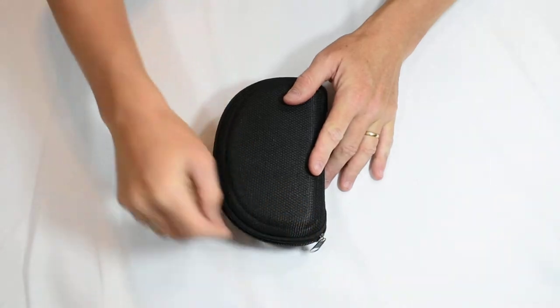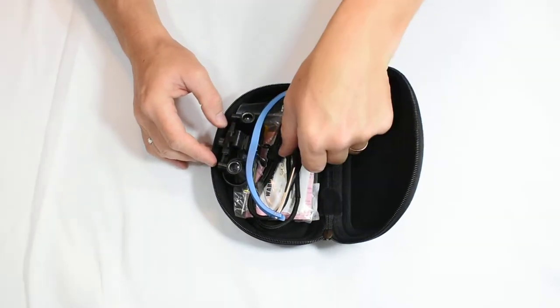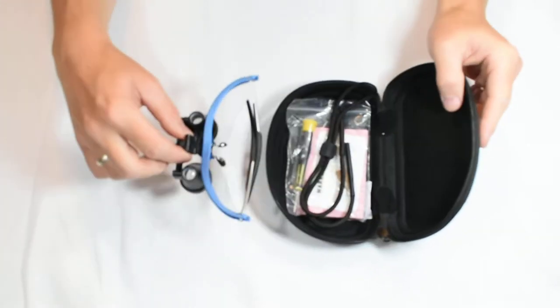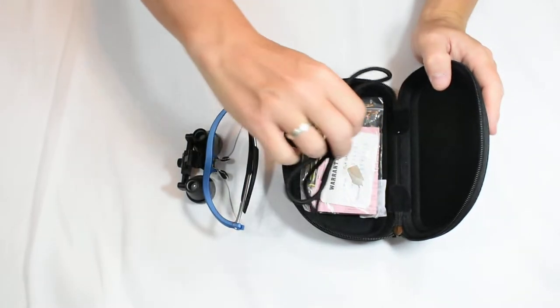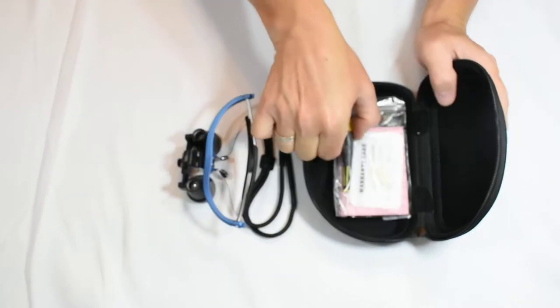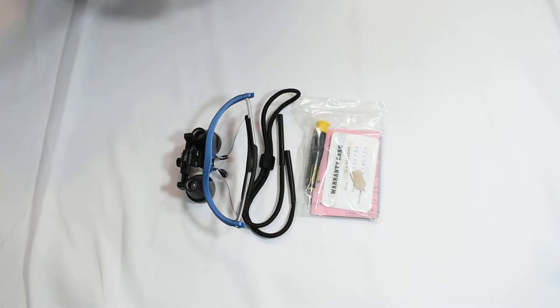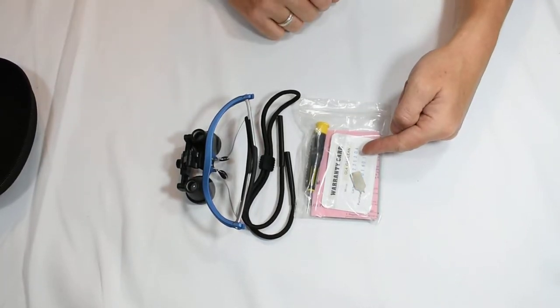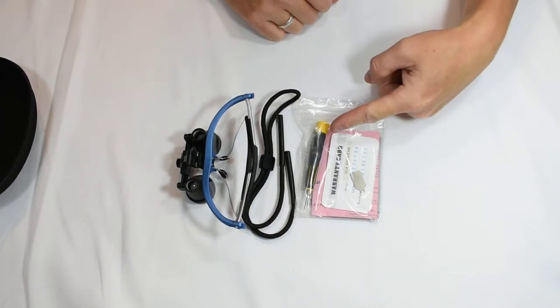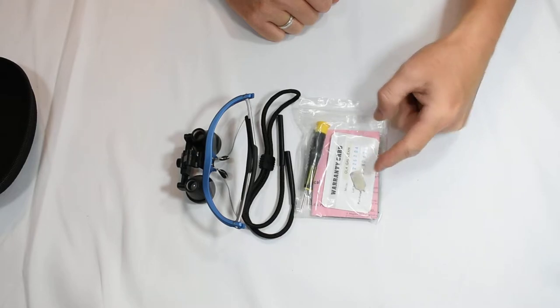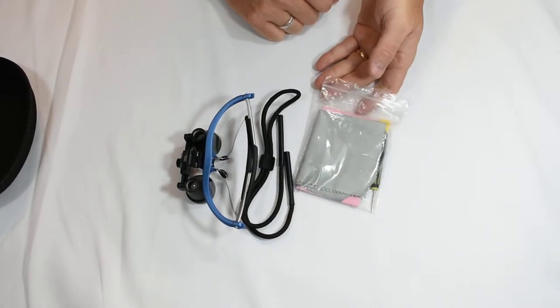As we open these we see inside our loops. Put those here. We see our head strap and then we have this accessory package which has our warranty card, instruction manual, screwdriver, flange tool, and cleaning cloth.